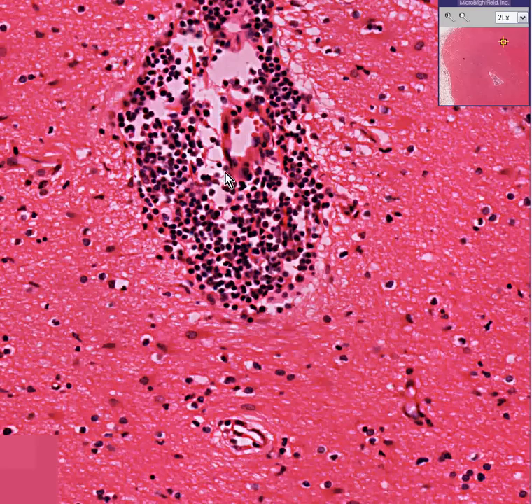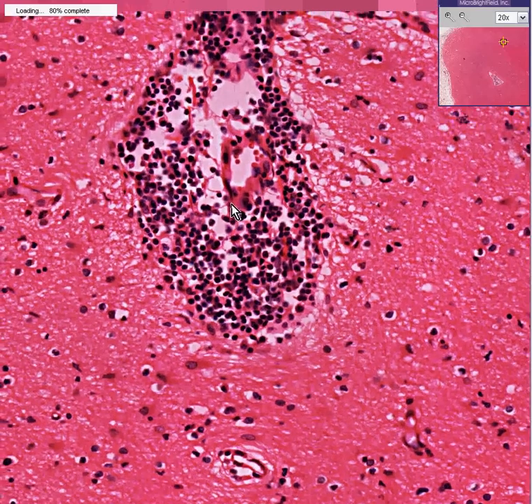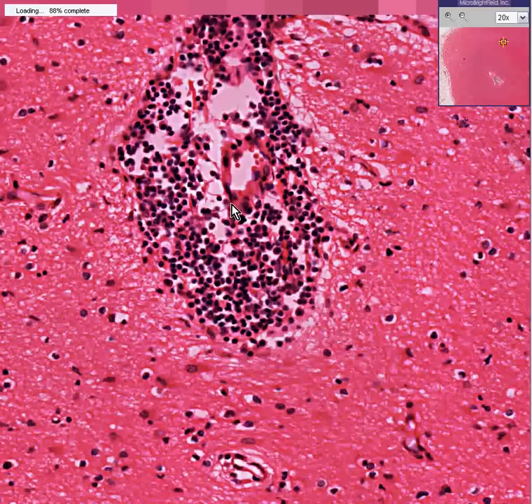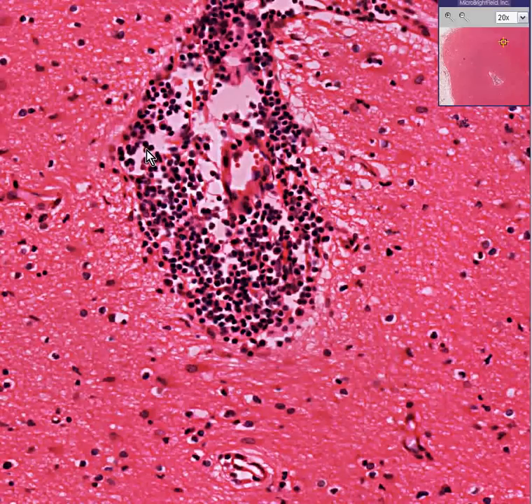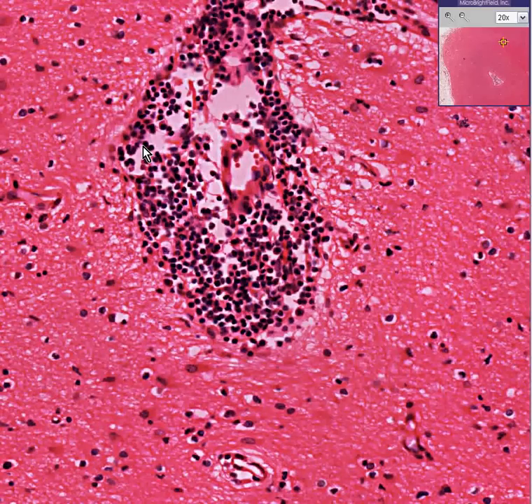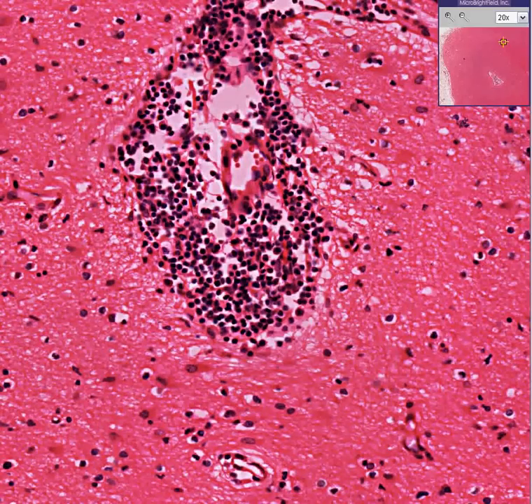This is an encephalitis pathologically. Clinically, it's producing a syndrome called paresis. And thank you very much.